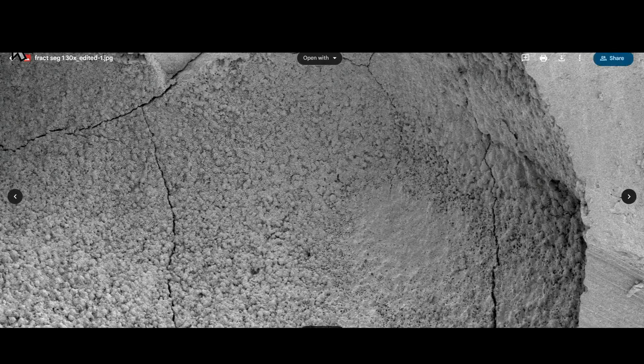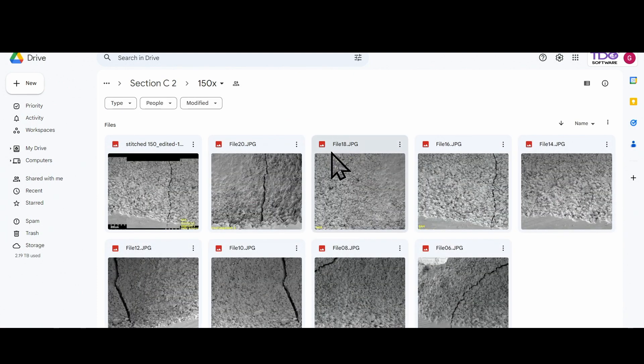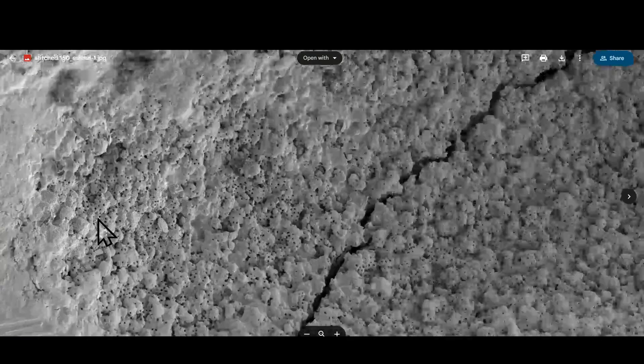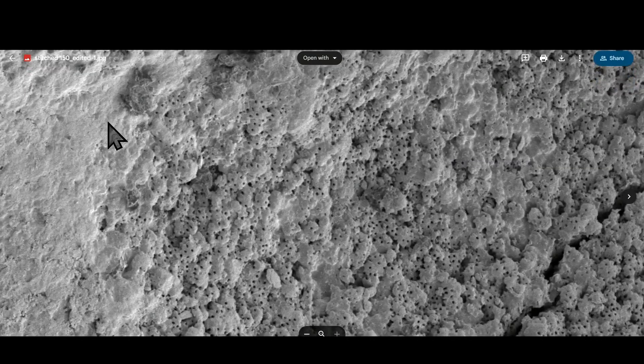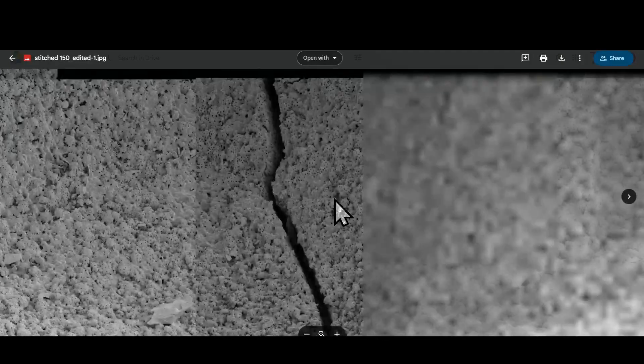And now, looking at the stitched area, you can see that it looks just as you would expect pre-dentin to look without any pulpal soft tissue present. Using the stitched approach lets you actually do a survey of the canal and get a global sense, a holistic sense of what was there.